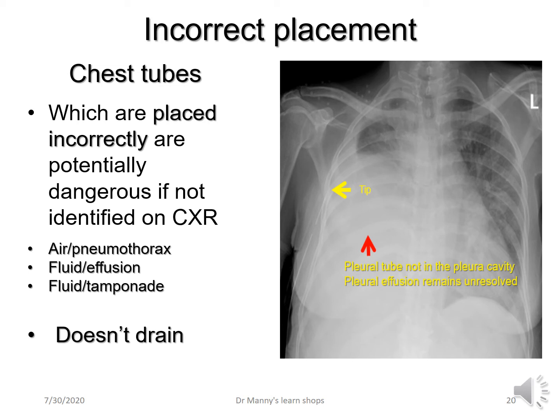It hasn't done what it's supposed to do. The pleural tube is not in the pleural cavity. The pleural effusion remains unresolved. It's not in the right place.